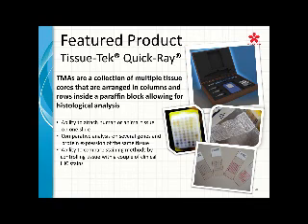Perfect. I have 2 more questions, and I think that might be all for today. One question is, we are preparing to begin doing the MART-1 in our Mohs lab. Any suggestions or recommendations? MART-1, Melan-A, is a great antibody. You retrieve that antibody by heat-induced epitope retrieval. So you want to do it that way.